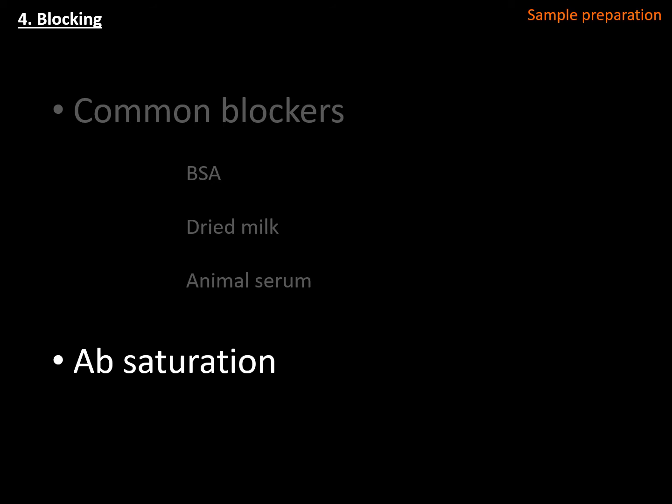This is especially important in polyclonal serums because they have a higher diversity of antibodies that are able to detect your target of interest and might have antibody species that are not as specific as you would wish for.